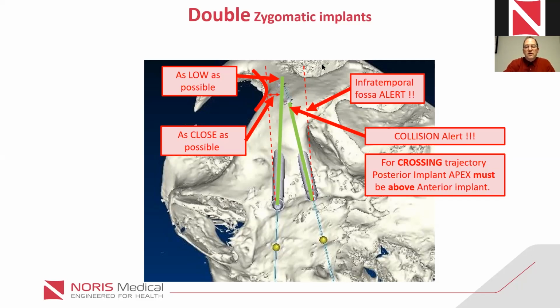Well, I will show in a minute how we find the entry point, but there are two points which are actually leading our implant. One of them, as I said, is the point where the implant is leaning on the crest, and relative to this point is the entry point. And the entry point is crucial to put the implant in the right position. So I hope this answers your question.